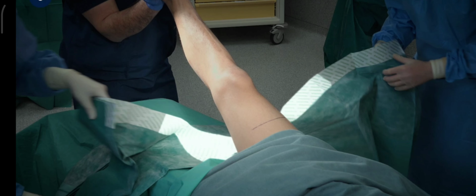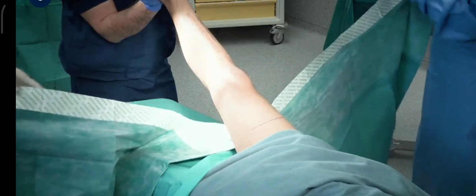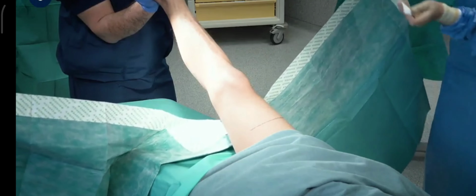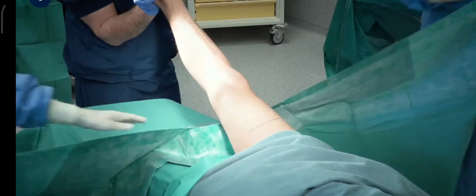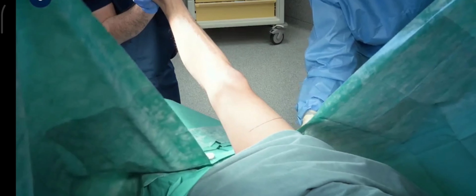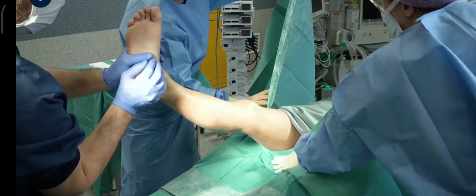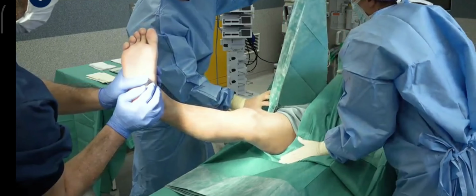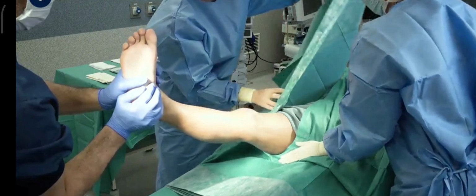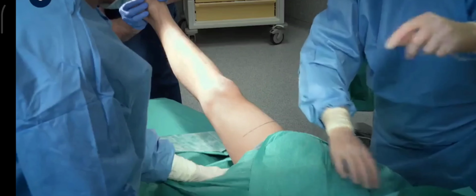With the bottom of the U positioned at the proximal end of the surgical site, the U-sheet is then unfolded and the strips covering the adhesive part removed. With this done, the bottom of the U is stuck down and then the arms of the U are stuck down across each other to extend the sterile field proximally. Take note of how the surgeon and scrub nurse do this one at a time and not simultaneously.